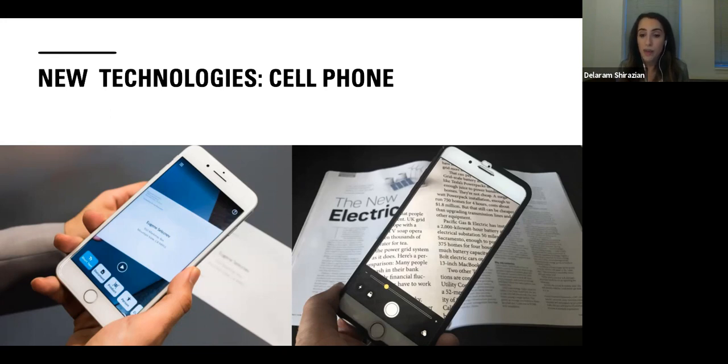And if you turn on the magnifier, the camera is utilized in order to basically have an electronic magnifier right there on your phone. So with this little sliding scale, you can increase and decrease the level of magnification. And with these three little circles down here, if you can see my mouse, you can also change the contrast, which is really, really cool.